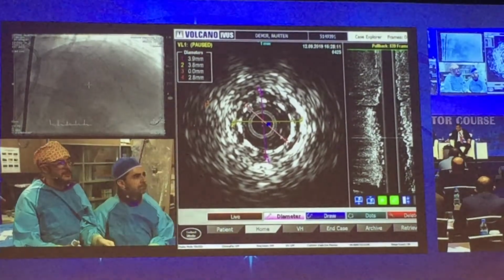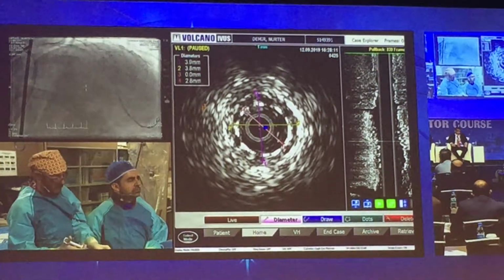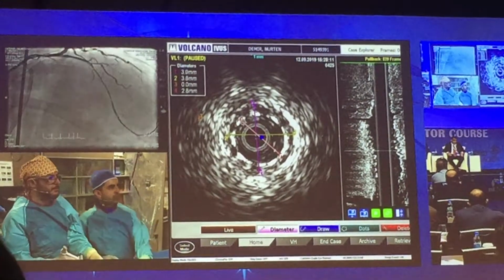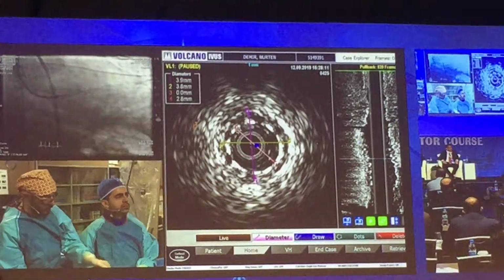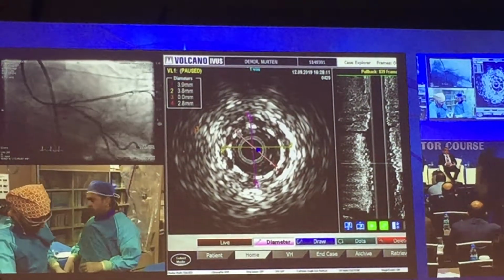We have already done that. It looks like a spasm or something like that, but I think there is the lesion. I'm not sure about this. You're right. I was okay. This is not the spasm.